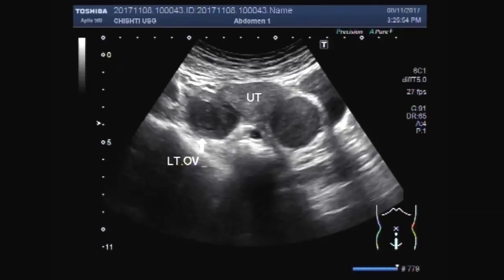This is the left ovary with a hemorrhagic cyst.